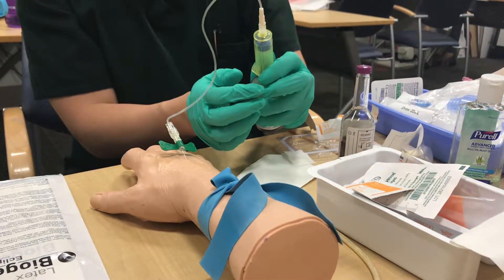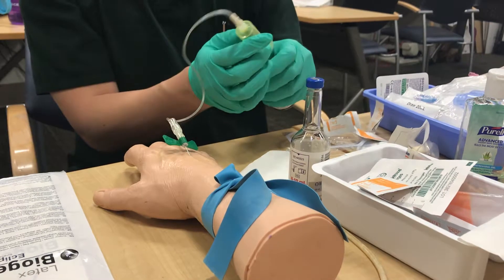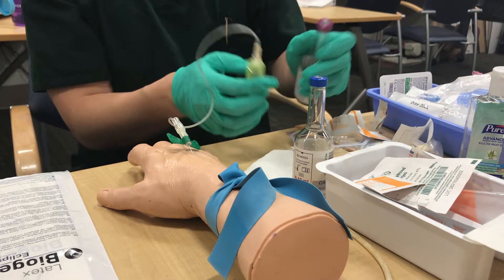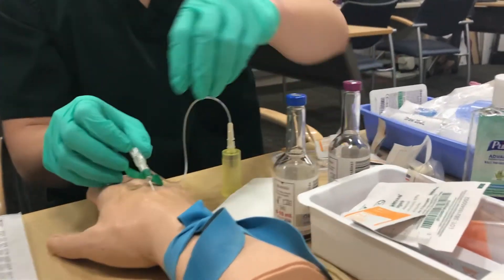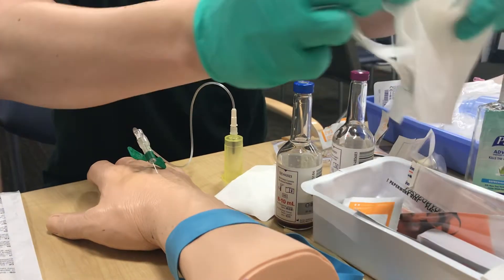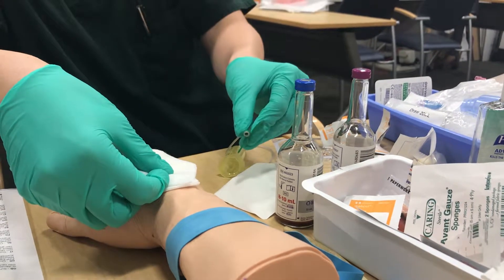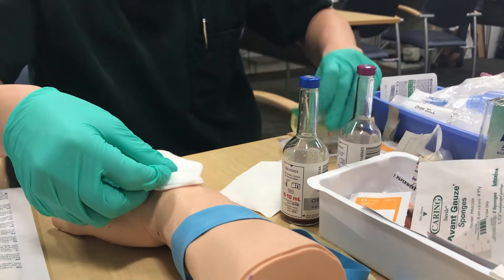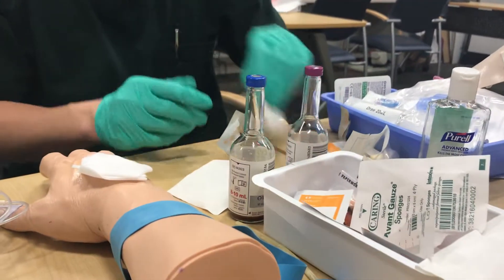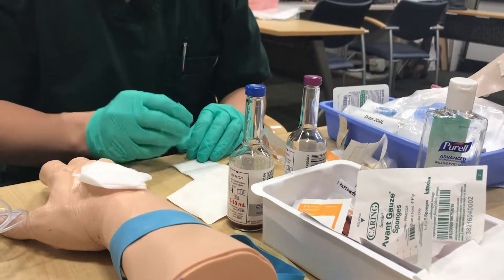Once you get blood return or flash, put it in the bottle and get your 10 cc's for the aerobic, then the same for the anaerobic. Undo the tourniquet, get your gauze, pull it out of the patient, and always make sure to put the safety on. After your patient is attended to, go ahead and label your bottle with your initials, the time, and the site.